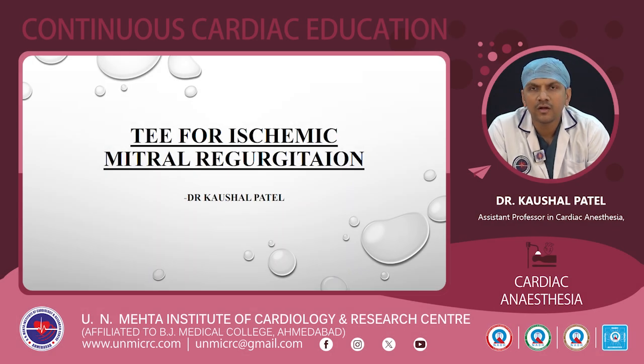Good morning all. Today's continuing cardiac education lecture is transesophageal echocardiography for ischemic mitral regurgitation.